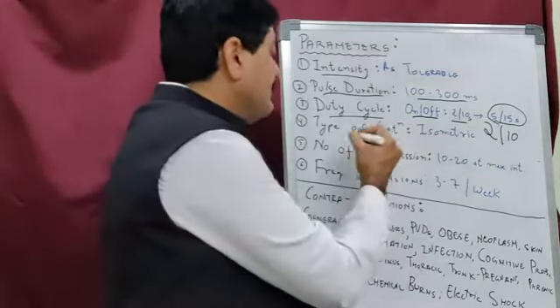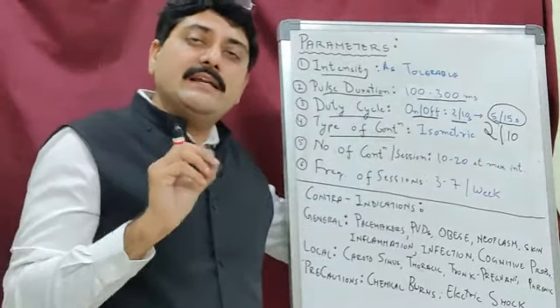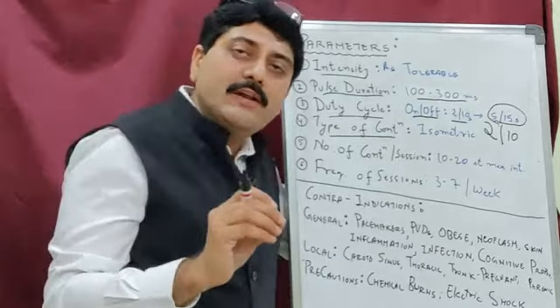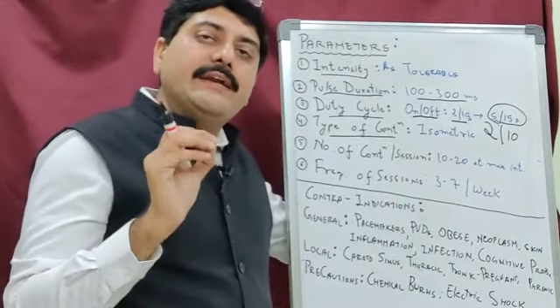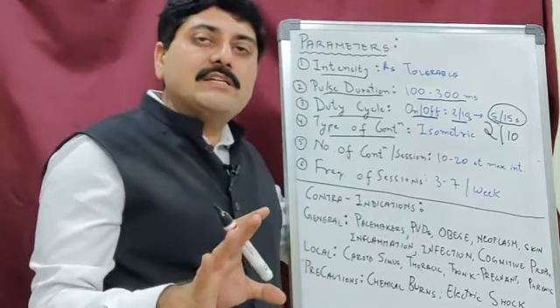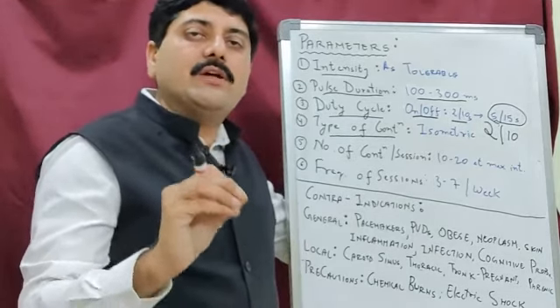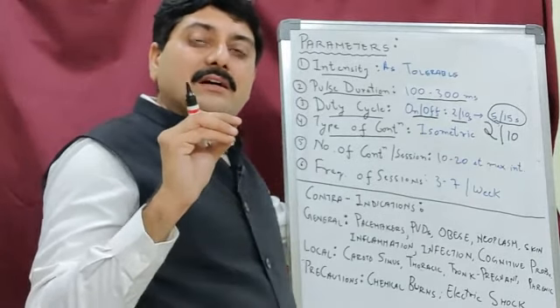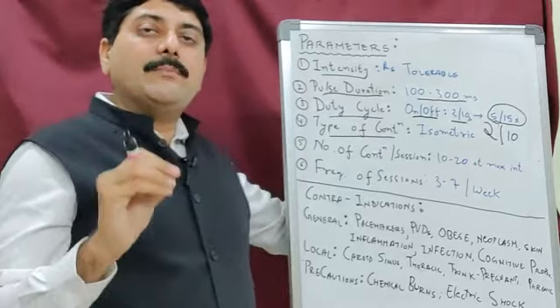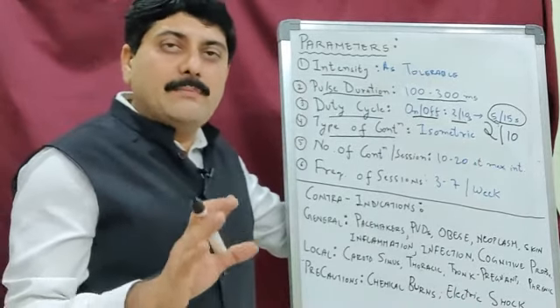This is very important. Then what type of contraction? As I said previously also, initially we are going to start with the isometric type of contraction where we do not intend to see the movement. We just want to get the contraction of the neuromuscular unit, the minimum visible or minimum palpable contraction, whatever is tolerated by the patient.